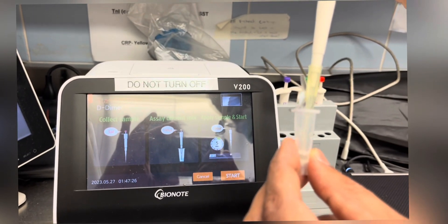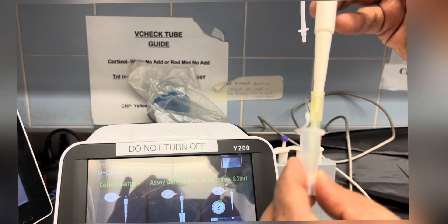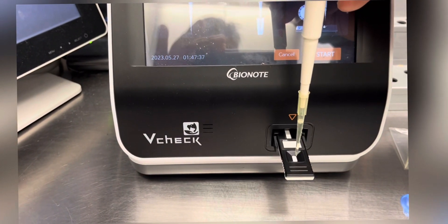Using the 100 microliter pipette, we usually add the entire sample into the sample well, and then click start.